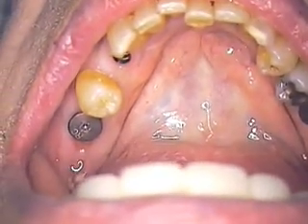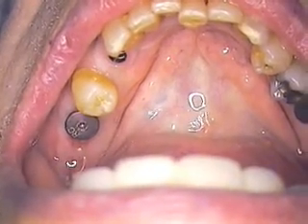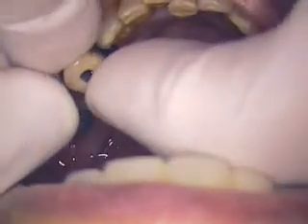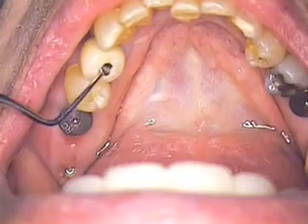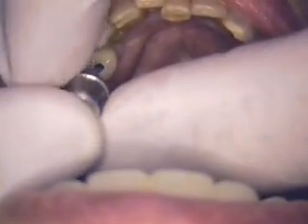As we seat the screw-retained bicuspid first, a couple of things we're going to check. Number one, we'll check the contact area by asking Ken if he feels pressure between the placement of the implant crown and the embrasure spaces of the natural dentition. We want to make sure we're not pushing or leaning on an adjacent tooth while screwing it down, which could orthodontically move that tooth. We're doing this without any anesthetic.